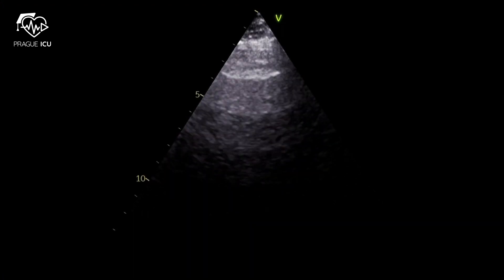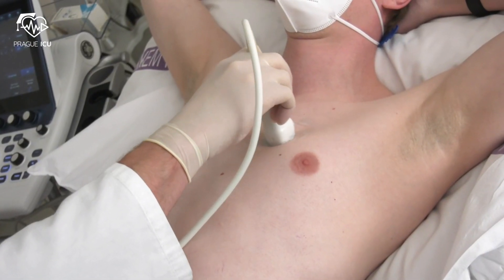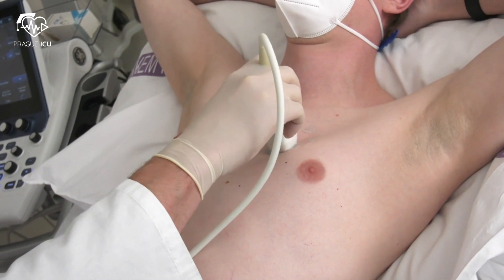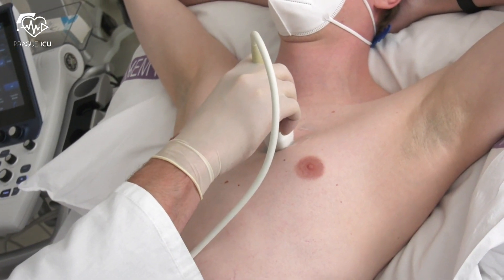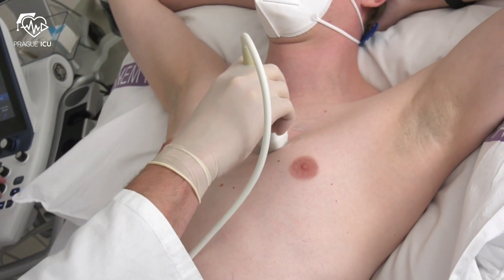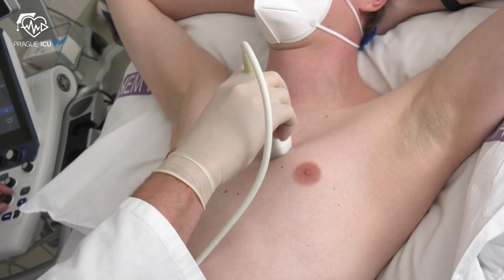We perform the same examination in the anterior part of the left hemithorax, checking both superior and inferior zones.